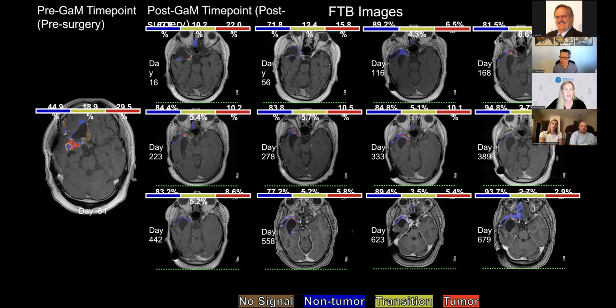I think they would talk to their neuro-oncologist or their neurosurgeon, who then probably communicates with their neuroradiologist and says, hey, we'd like to do a DSC perfusion scan. They can point to the papers in the literature and say, these papers outline how to employ it, and we're interested in getting that to provide more specificity of our diagnosis.